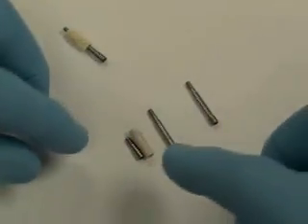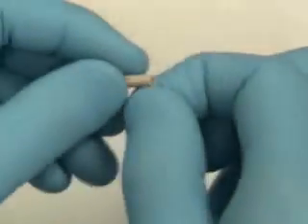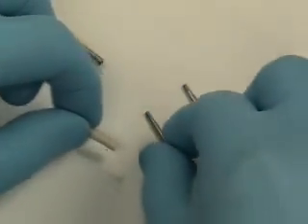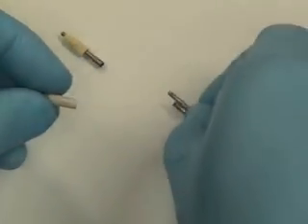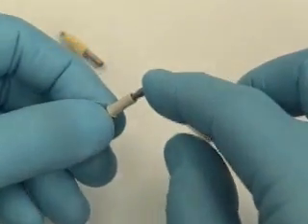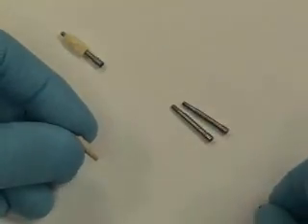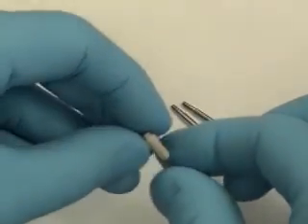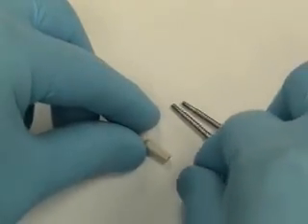The nice thing about this particular system — the Implant Direct system — is it comes with a short screw. Then separately you buy the long screws that you can reuse to index your abutment with your provisional, and then you don't have to cut it. You just use the small screw, which is really convenient, especially in this case where we made our provisional ahead of time.